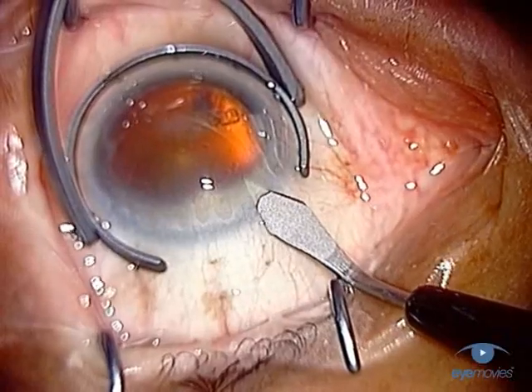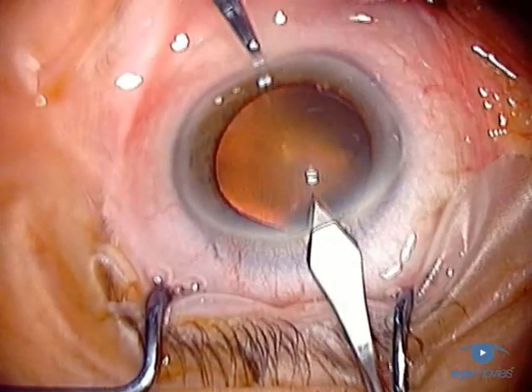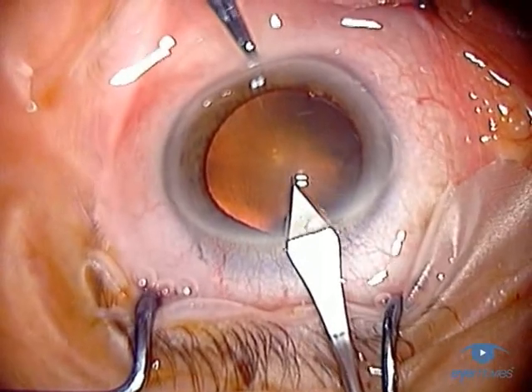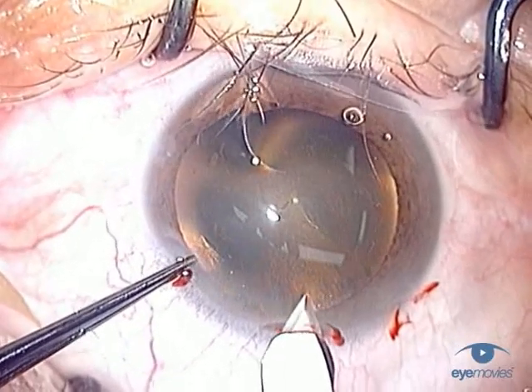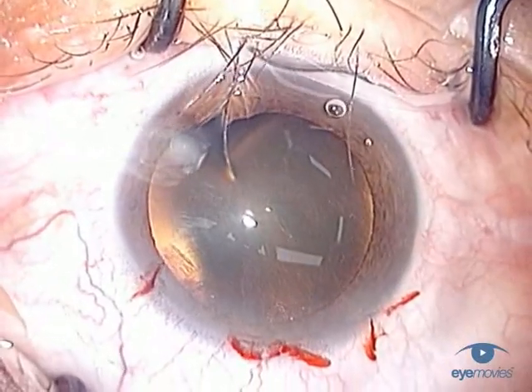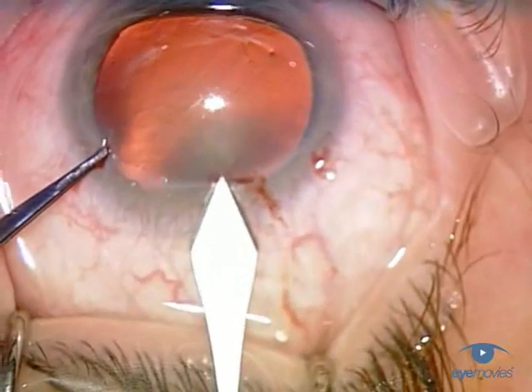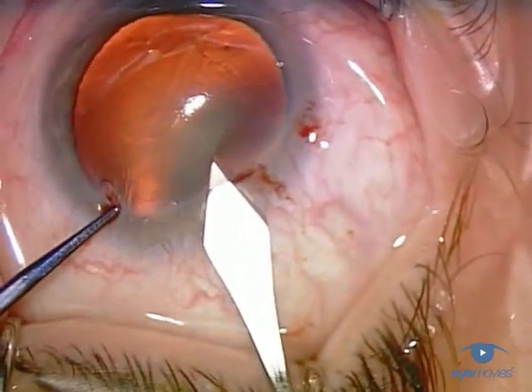For fixation, you can use either a limbal fixation ring or alternatively grasp the limbus with toothed forceps directly opposite the incision. You can grip the roof of the paracentesis or the limbus beside the incision, and this usually works fine. But occasionally you'll get poorly controlled rotational movement of the eye, particularly if the keratome is less than perfectly sharp.